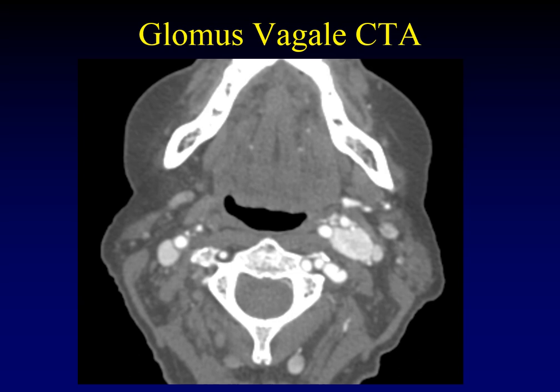On CT angiography, once again a very vascular tumor — essentially as vascular as the surrounding arteries and veins. Notice how the internal and external carotid arteries are both being pushed forward and not splayed apart. What's being splayed away is the internal jugular vein.